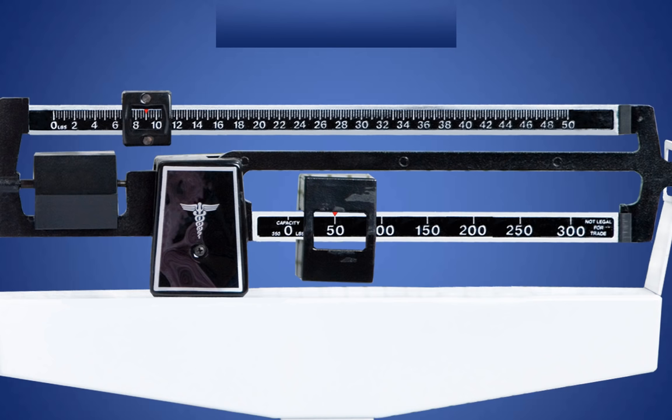Now we are ready to calculate the total weight. To calculate the total weight, add the weight displayed by the large weight indicator on the bottom bar to the weight displayed by the small weight indicator on the top bar. In this image, the bottom bar has a large weight indicator on 50 pounds. The top bar has a small weight indicator on 9 pounds. Add the bottom number to the top number and you will arrive at the total weight of 59 pounds.